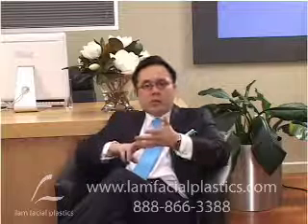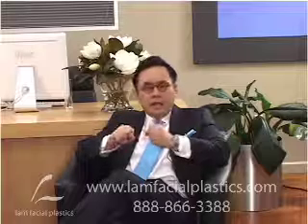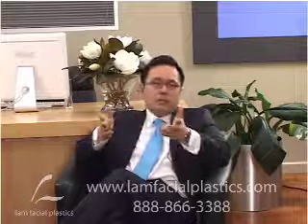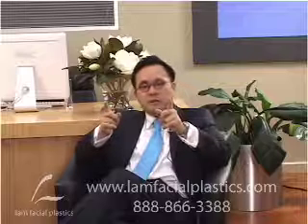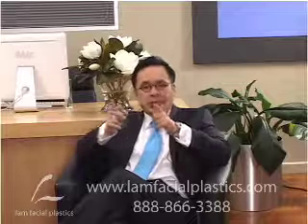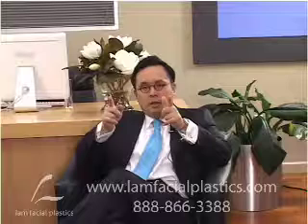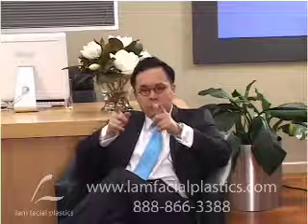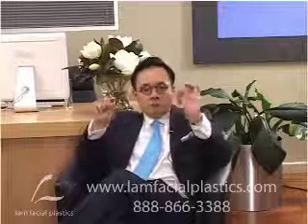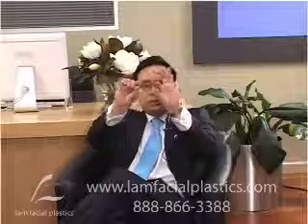There's also a lot of other problems with solid implants. They become infected potentially, they shrink, they get harder, and they don't look natural. And part of the reason why is if you think of the two options for a solid implant, one is you can put the whole solid implant in, or you could put little segments in. Let's consider both options. If you put a full solid implant in, it can also shrink over time. But in addition to that, it just simply feels hard. And it looks terrible because when you look at it, it's a single sheet.